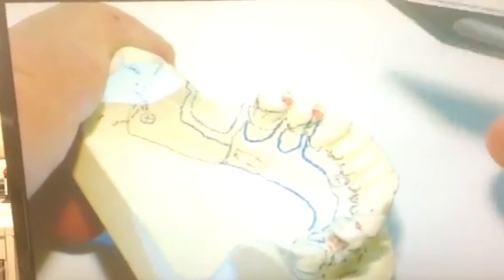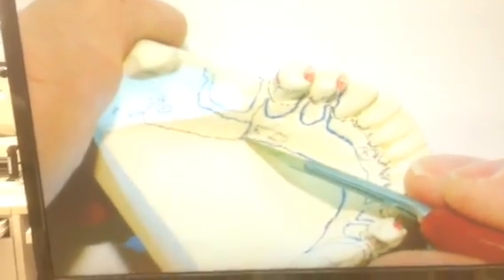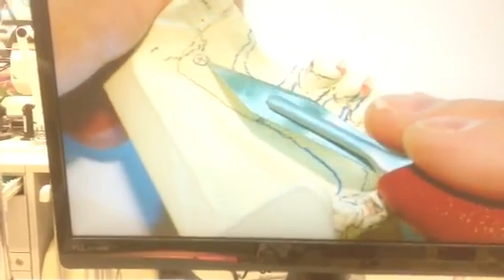Again, just my preference. I'd say this would be a tooth drawing, because it looks kind of sketchy to me. It doesn't look like a crisp Dr. Smith drawing. Nice butt joint here. Don't forget your stop. Don't forget your tripod marks. These are gimmies. You just get those points. But they're easy points to forget. Don't forget to mark the guide planes.